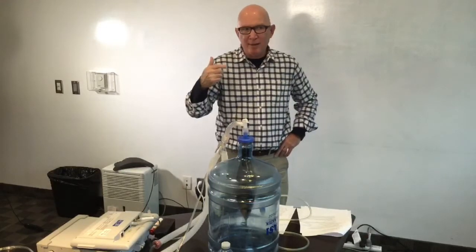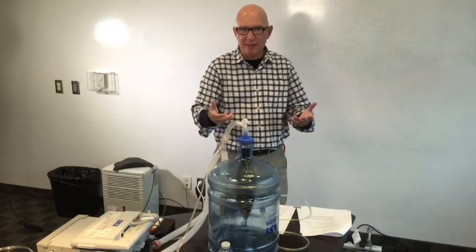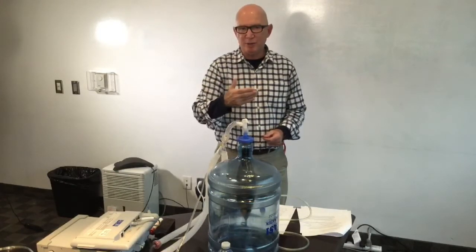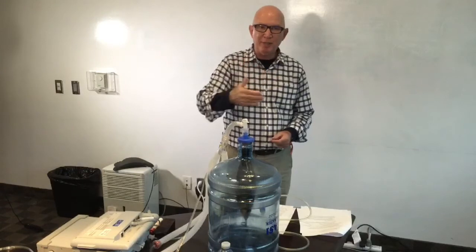Now, the idea then once more is that if you're taking all the work of breathing away from an individual, and that's your desire, then an AC type of mode is the one that's going to do the best work for you, because those individuals will get the same consistent volume every single breath. Therefore, your cardiac output will be the same as well.